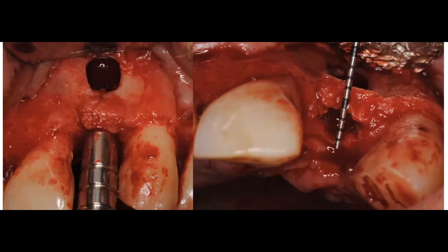So here you go. We're using our last dilator. Then we're going to go ahead and remeasure, and you can see on the right hand side that we have been able to push that little bit of coronal bone left, to the 7 millimeter width. And now we're going to go ahead and fill that site with bone.